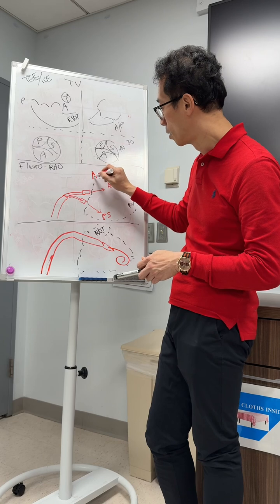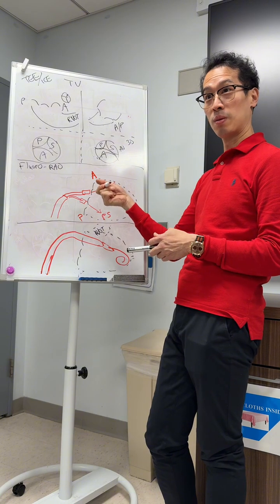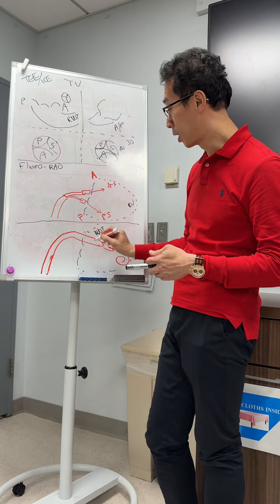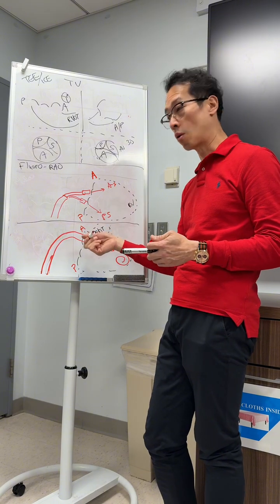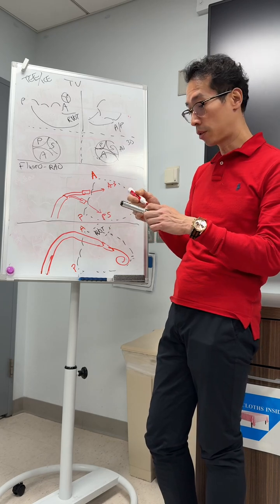Again, this is A and P. Remember, septal is behind you, right? On this view, the left ventricle is behind this screen, this board. Same thing here. Anterior, posterior. Again, septal. So you don't know how septal you are with either orientation. That's why you need to look at echo, right, to see.